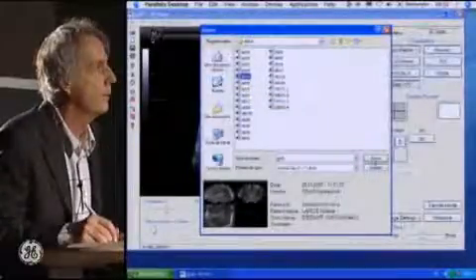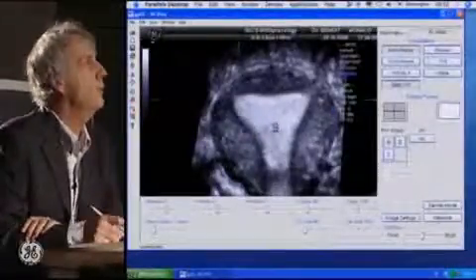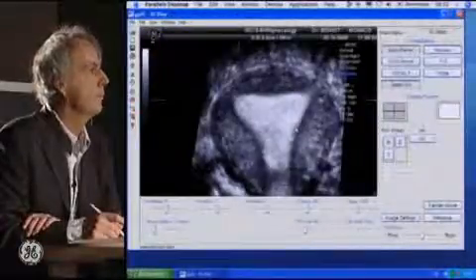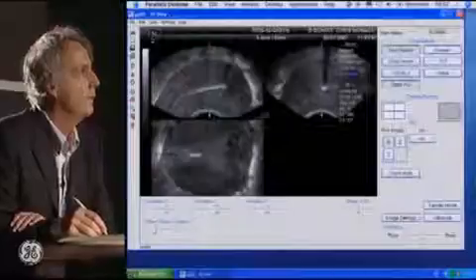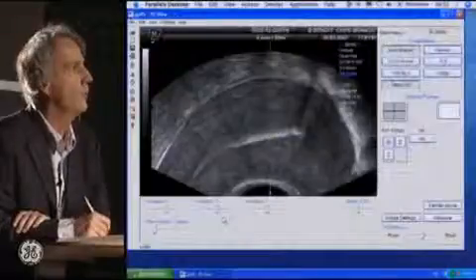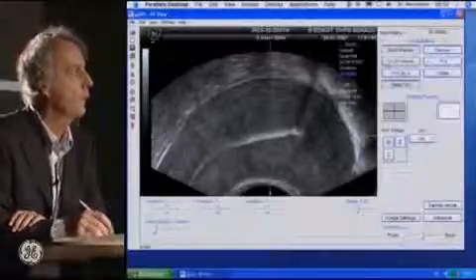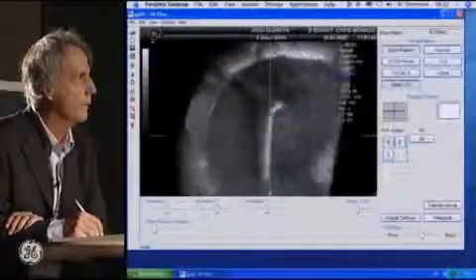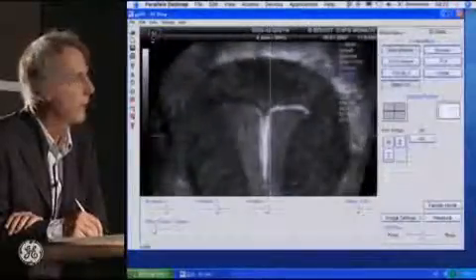We will do it with the intrauterine device because it's more easy with the intrauterine device. You have the intrauterine device here. The acquisition was made here. So I put the dot inside. Now I will use a section plane, and after I will improve with a static VCI. You turn like this. You turn, and you can see the intrauterine device inside.